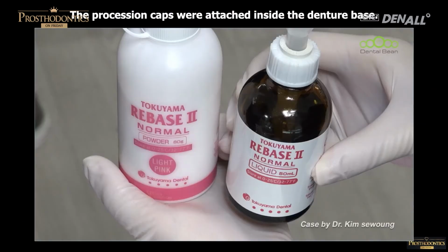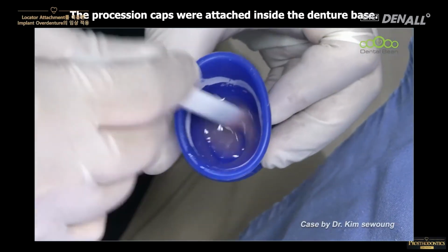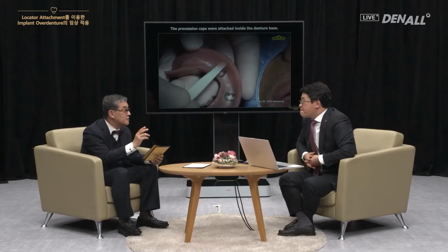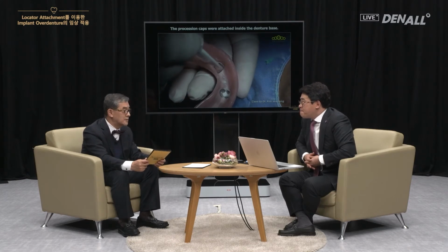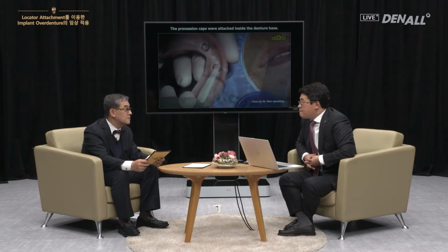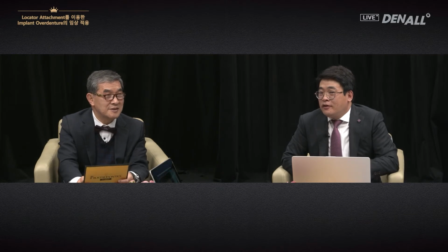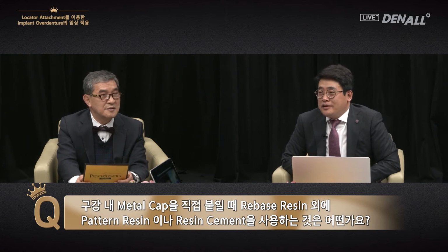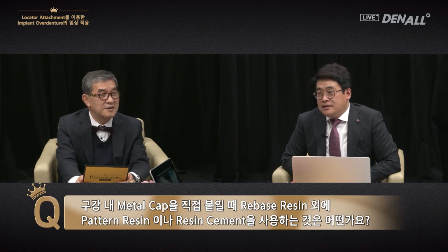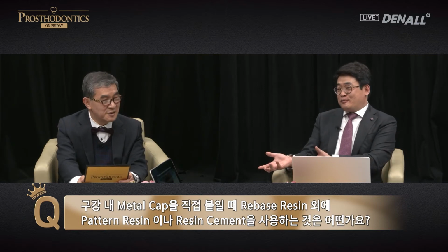After that, I use rebase resin to cement the processing cap on the inner surface of the denture. You use rebase, and I also use rebase. It comes in different names depending on the vendor. Some people use direct resin, pattern resin, and resin cement. What do you think about that? I think you should use what is most comfortable to you. Personally, the pattern resin is too red and resin cement is a bit expensive and technique sensitive, and therefore I use base resin.